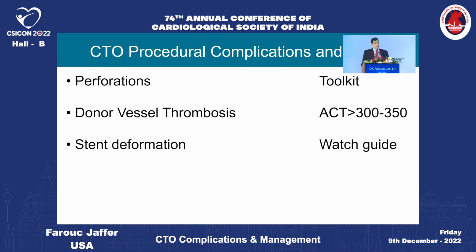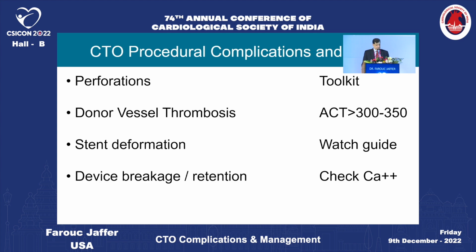Stent deformation is something that probably is not talked about too often, but certainly from initial guide manipulation and guide extension manipulation, it's really important to recognize that longitudinal stent deformation can occur, and then actually during post-dilatation, delivering stiff balloons, there can be stretching within the stent, and that can lead to needs for restenting. So it's important to deliver those post-dilatation balloons gently and safely.